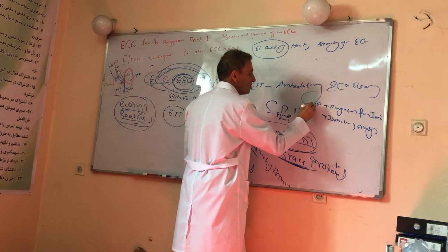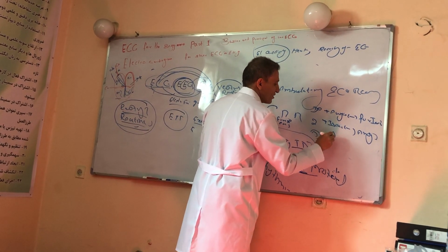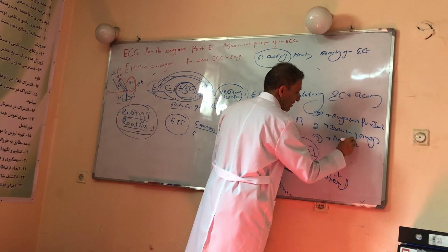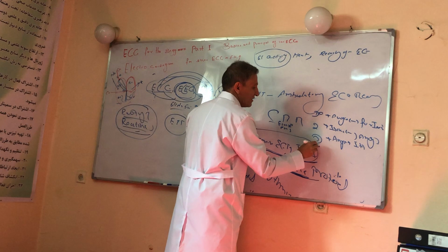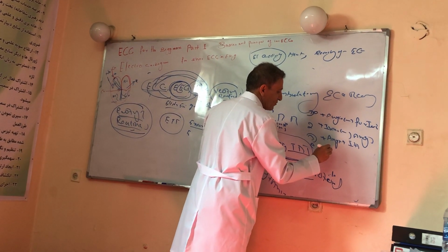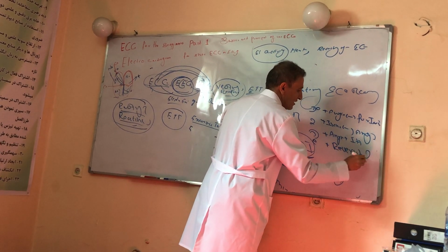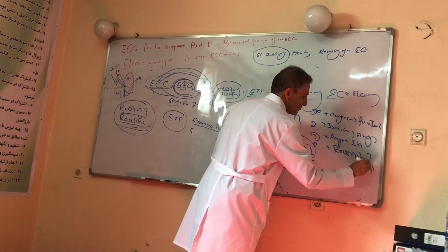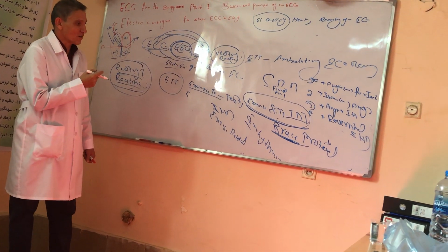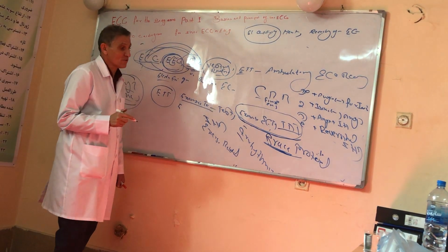Number 3, this test is positive for angina as well as ischemia. Finally, this test will be used to detect reversible ischemic heart disease. This test is called Bruce protocol or modified Bruce protocol.